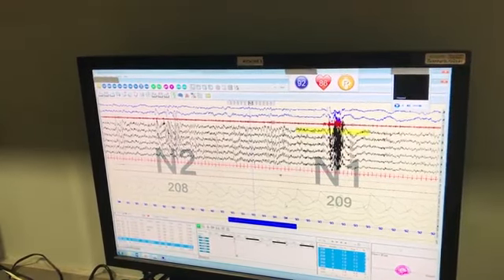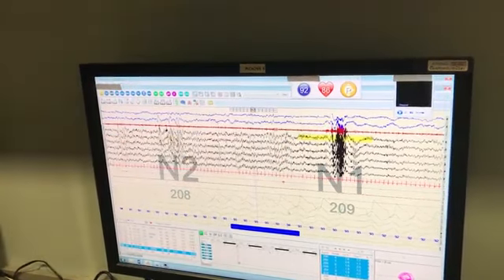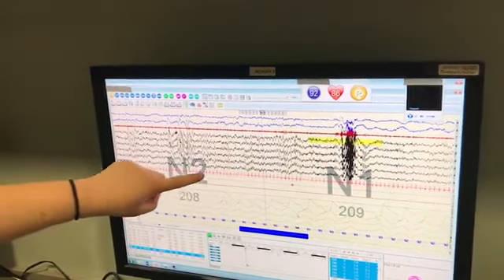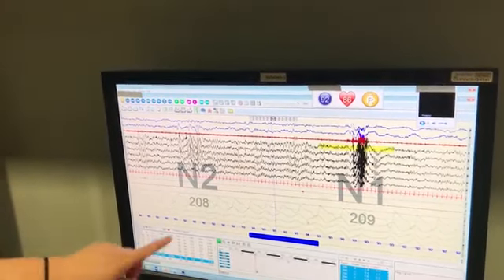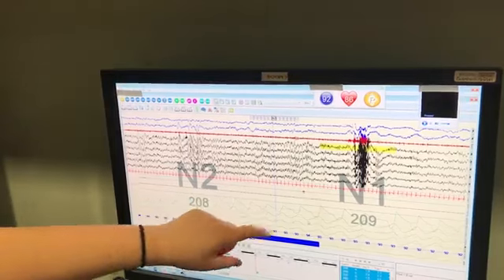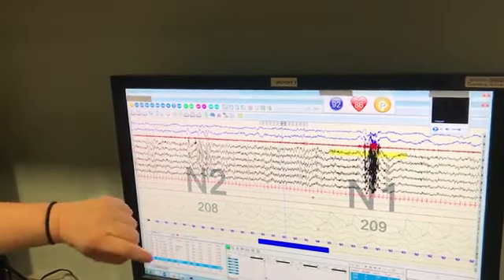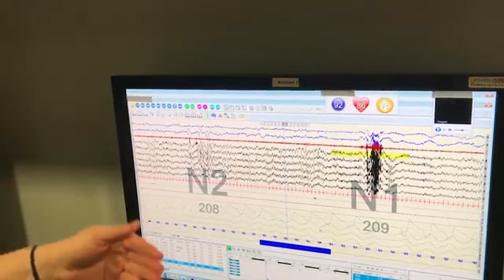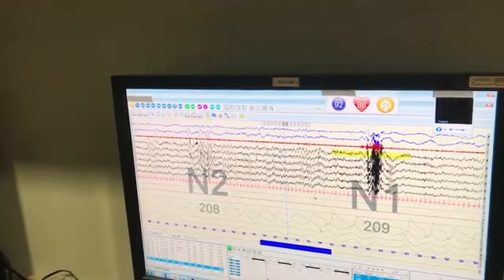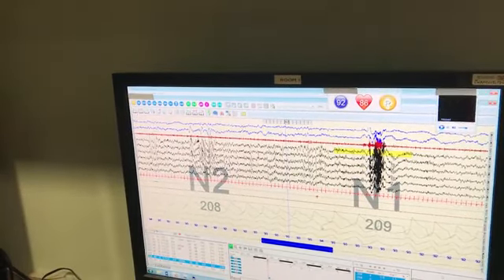Other than that, we are monitoring what your oxygen level is, your heart rate, your body position. We're also monitoring your heart on our screen to see if there are any type of abnormalities. We're looking at your breathing patterns down here. These little squiggly lines in the middle, as some people would call them, are your brain waves. And so we have to monitor those to know if you're awake or asleep, and then also what stage of sleep you are in. So this is basically the screen that we look at night.